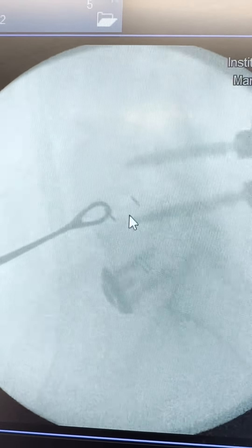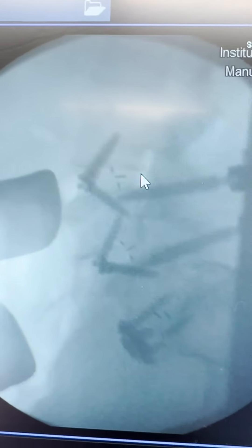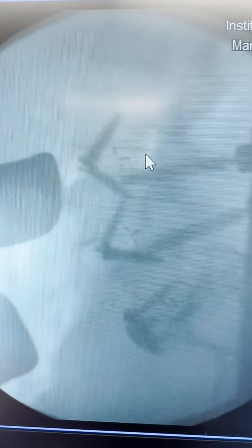These are intraoperative pictures from a few months ago when we did the anterior procedure. That's from the front intraoperatively. This was the pre-op, and we're just trying to localize the incision. It came out right here, and then this was the operative result, all from the front.